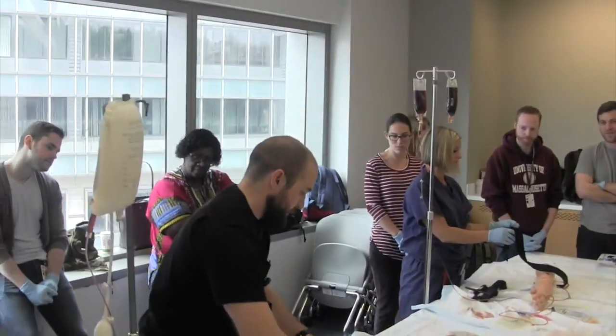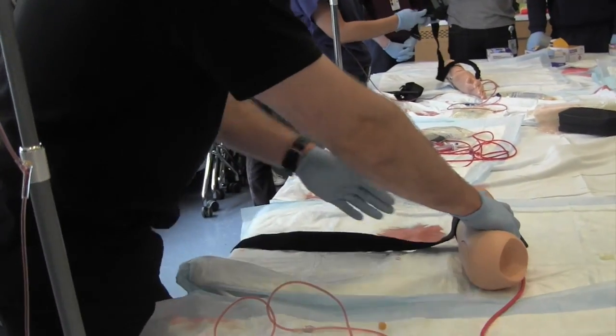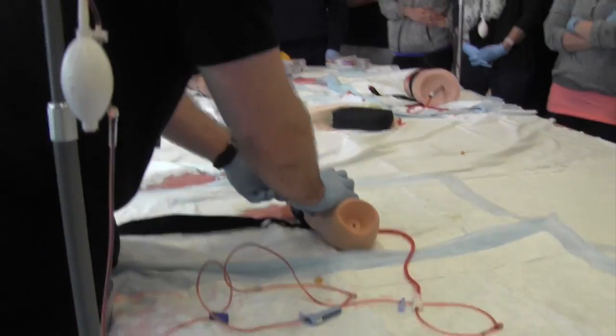The first step that you really want to get right is to cinch it down as hard as you can to help overall stop the bleeding, then velcro it. You don't want to be able to get a finger under there.